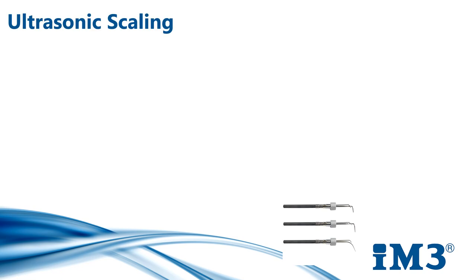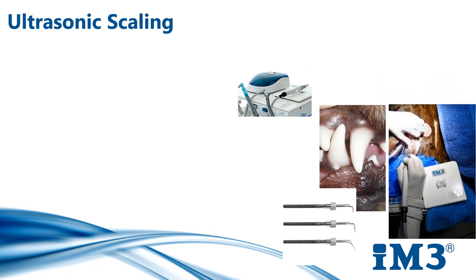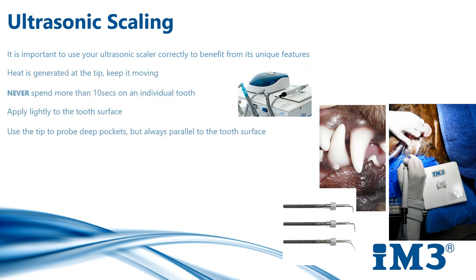Energy dispersion for the magnetostrictive scaler makes all its sides effective. The greatest amount of energy is produced at the tip, therefore the tip should never be directly applied to the tooth surface. Always use the tip parallel to the tooth with the side of the tip on the tooth. Do not use the tip as a pick or chisel at right angles to the tooth as this will scratch the enamel.